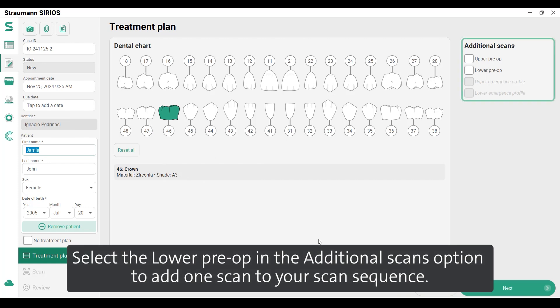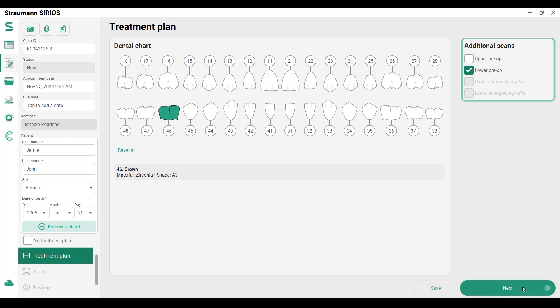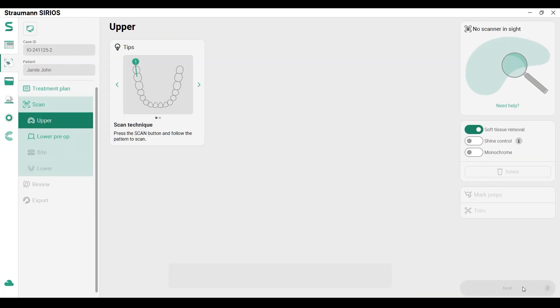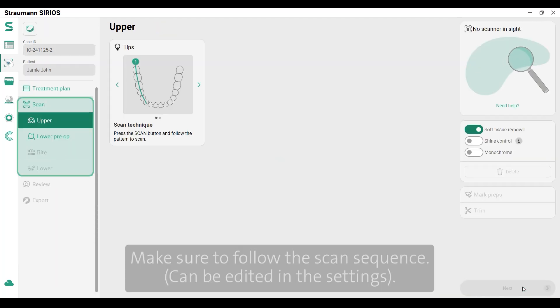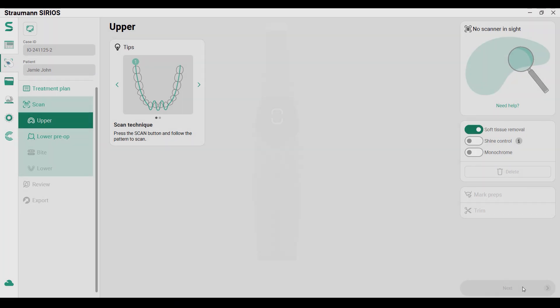Select the lower pre-op in the additional scans option to add one scan to your scan sequence. Click next to start the scan. Make sure to follow the scan sequence, which can be edited in the settings.